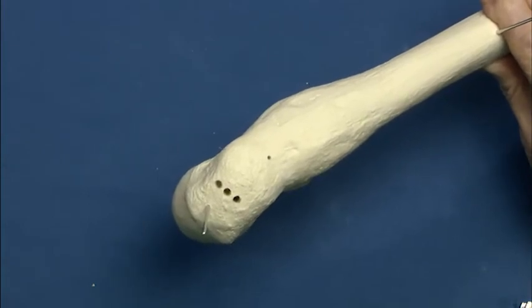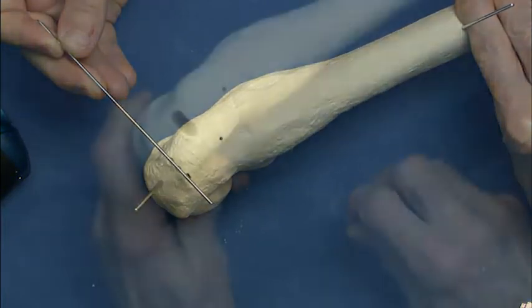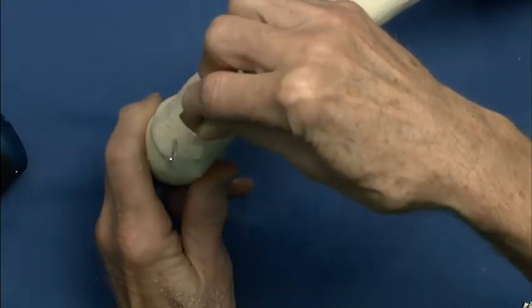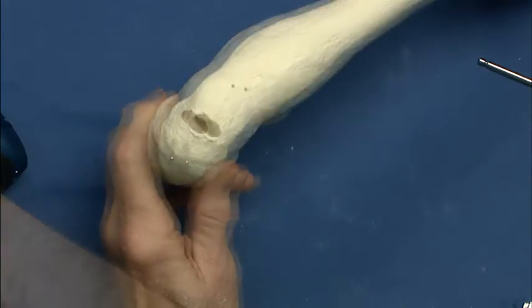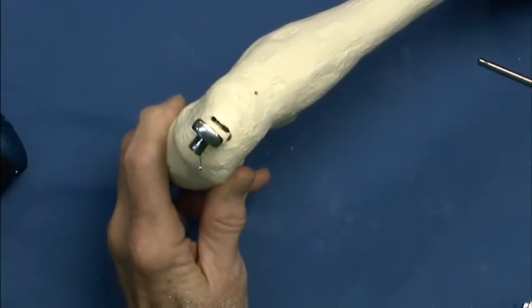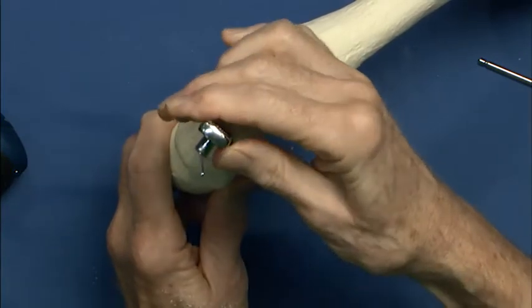Okay, so this is our initial portion. We've drilled 3 holes. So this is our 15-degree compensation for the sagittal plane. Okay, step 2 then has been use of this router. With the power, you can sort of machine it back and forth. And the goal is to give you a little bit of freedom as you insert the seating chisel in this plane, like that.